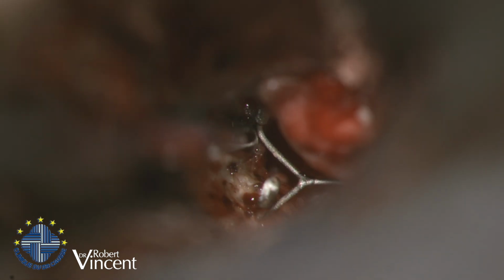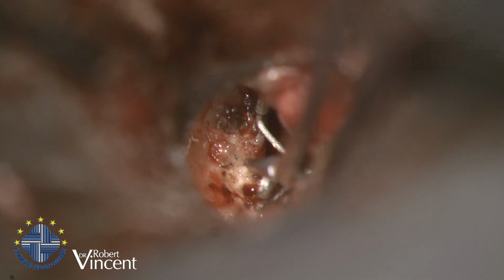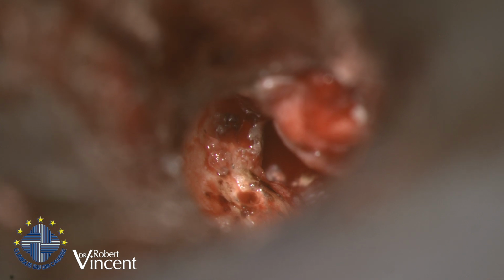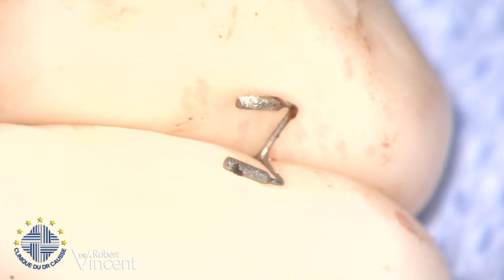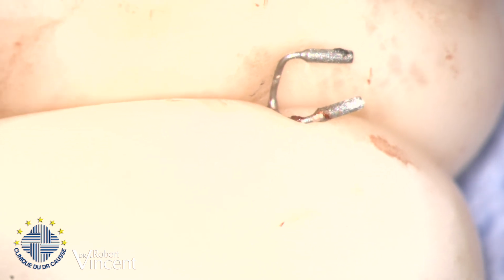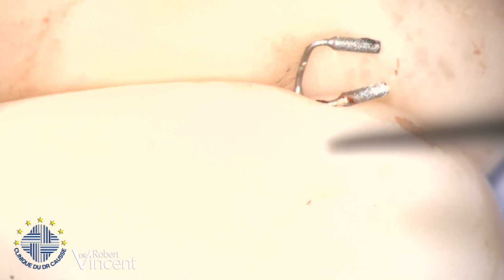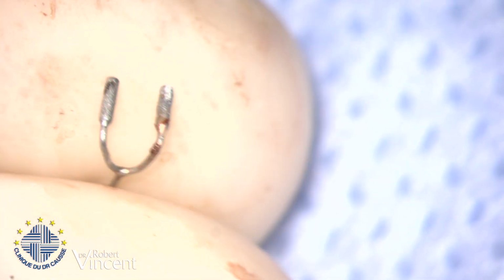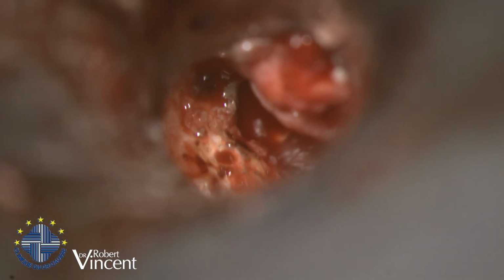Okay, la pince s'il vous plaît. Okay, I remove it and reduce the distance between the two hooks. That's better now. Pince s'il vous plaît. Okay, see, it's easy, eh? It's a nice way to reshape it. It was very nice. Okay, maybe a little bit too much, we'll see. This can be readapted from the inside.